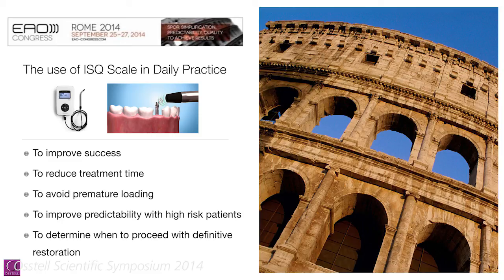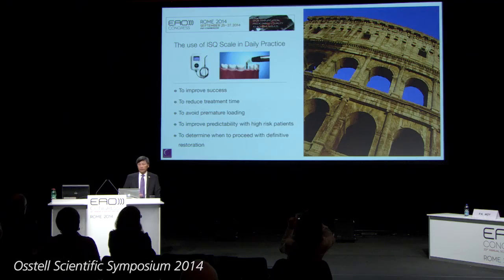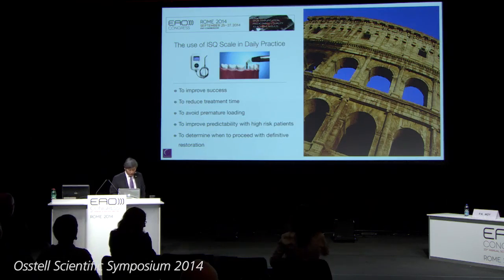I use it to avoid premature loading. I use it to improve predictability with high-risk patients, and I use it to determine when to proceed with the definitive restoration. This entire list is used to improve the success rate overall, long-term wise, for our patients.